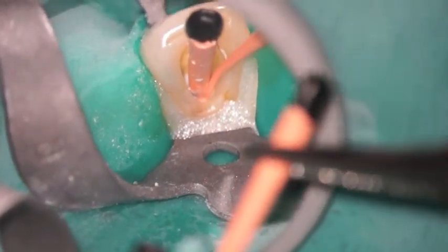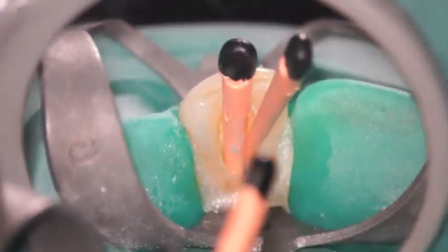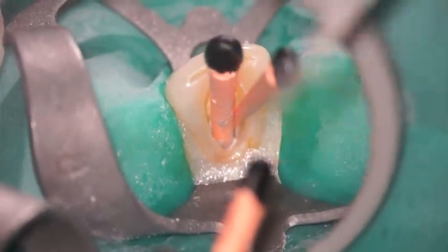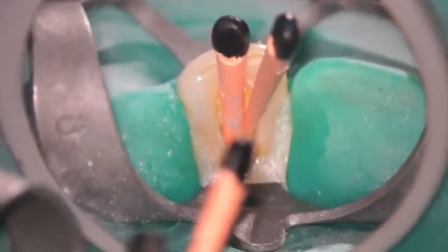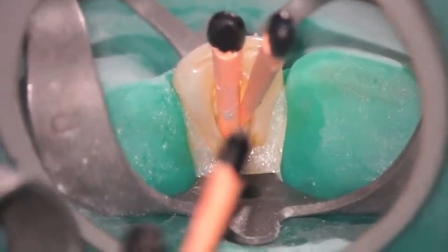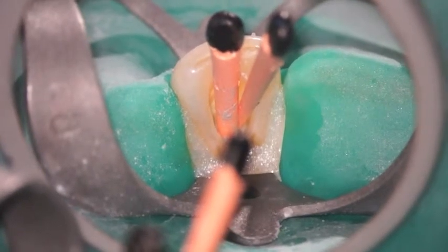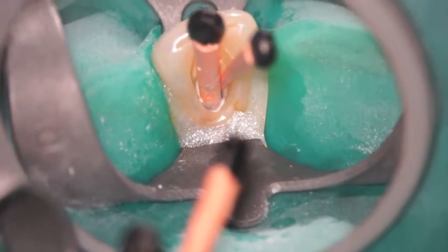In this particular case, because of the size of this particular tooth — I believe this tooth is like a number 10 or number 7, something like that — it's a very large root canal system, an anterior tooth. So I've placed more than one gutta percha cone in there so that when I sear it off, I'm capturing more rubber as I condense it vertically.